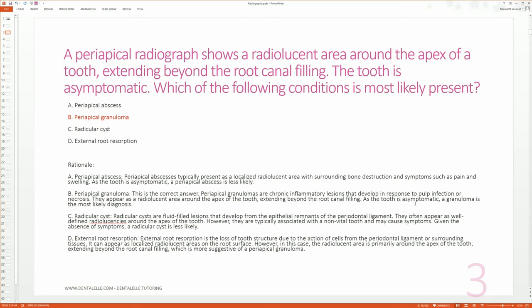They appear as a radiolucent area around the apex of the tooth extending beyond the root canal filling. Since the tooth is asymptomatic, this is most likely the best answer. What if you thought A was the best answer? Because in my early student years I would have thought A sounds pretty darn good too. But notice how with an abscess there's pain typically. You don't have to have pain just so you know with an abscess, but typically there is pain, and we're talking about the board exam here.